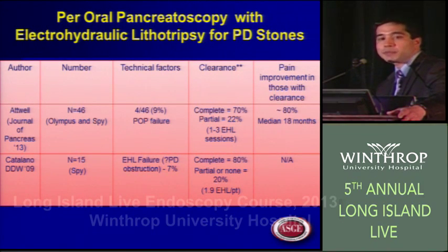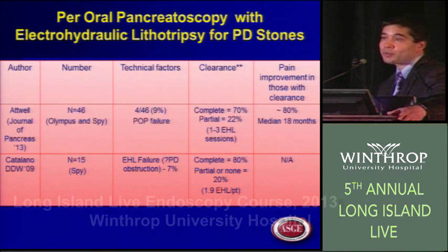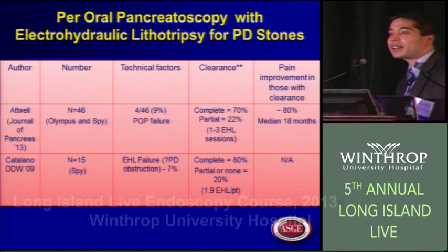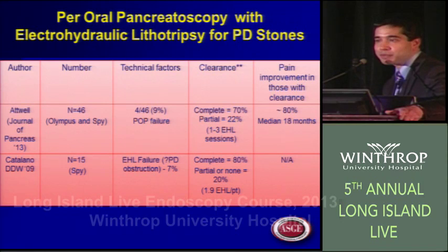So from a patient's perspective, in our experience, patients are alcohol-related, tobacco-related, sometimes genetic. The genetic ones tend to have less stricturing disease, but by and large, the more patients we see have downstream strictures. If they have downstream strictures, they're going to need stricture dilation and stenting. And at that same time, we can do intraductal lithotripsy. So to me, it just makes a lot of sense. We were working on doing a randomized controlled trial with 5 centers of using SWL versus pancreatoscopy, but it's been a little hard to put that together. But that's been my bias, using intraductal lithotripsy.